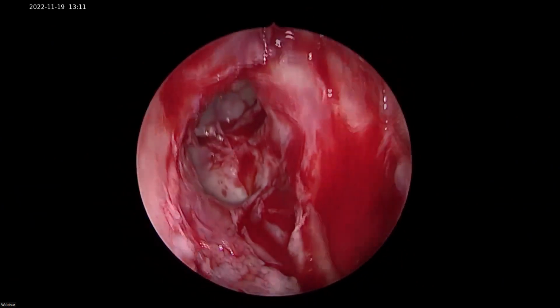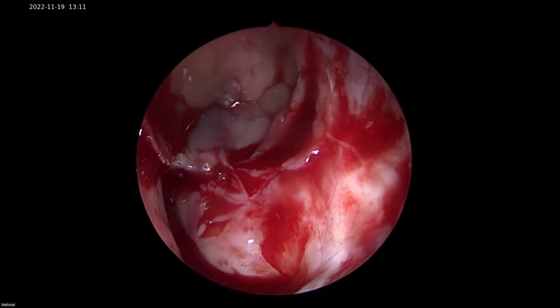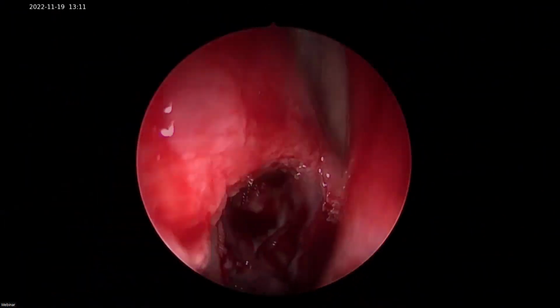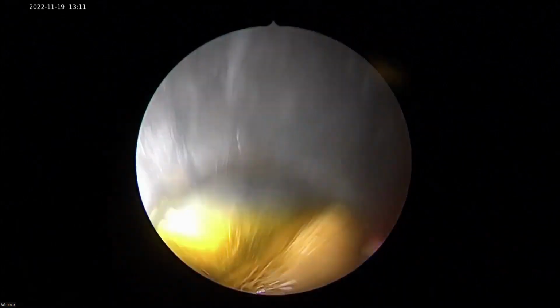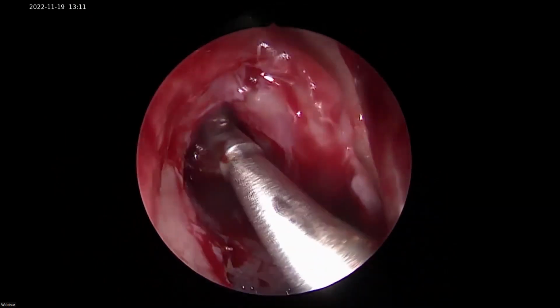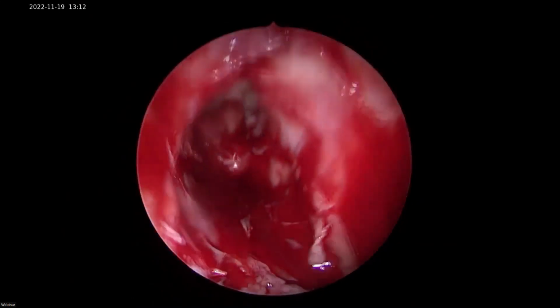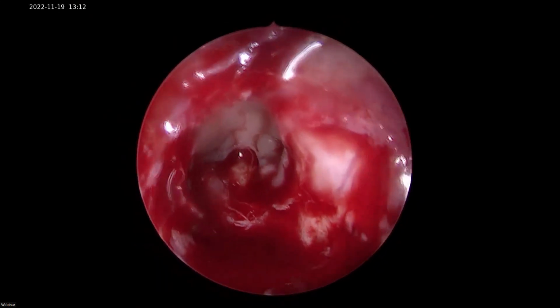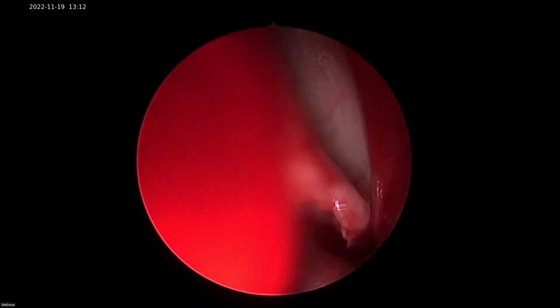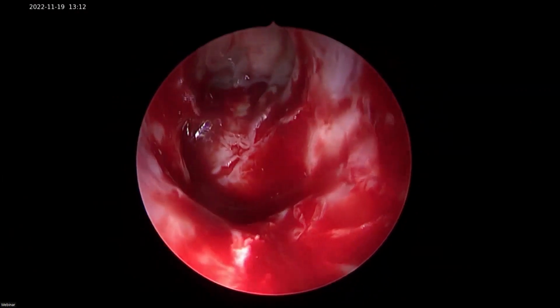Because the sinus is opened up, but you can see a wide opening now of the frontal. I wanted to remove the diseased mucosa, nothing else. So if we can remove, because I just want to make sure that there is no AFS there. No, anyway, it is becoming a raw area, so let it be. You can see that there's a cobblestone appearance of the mucosa of the frontal sinus, and on aeration it's going to become better.